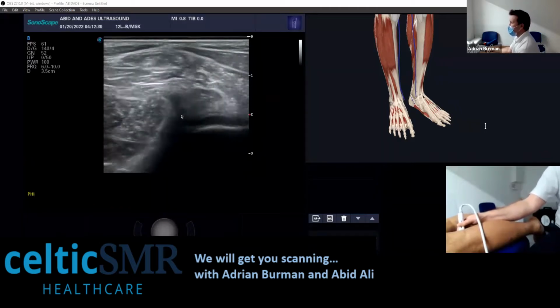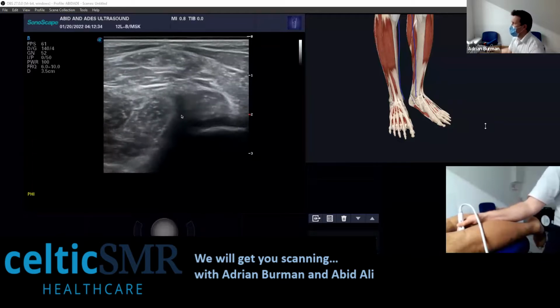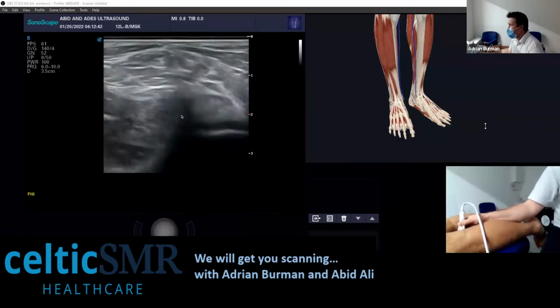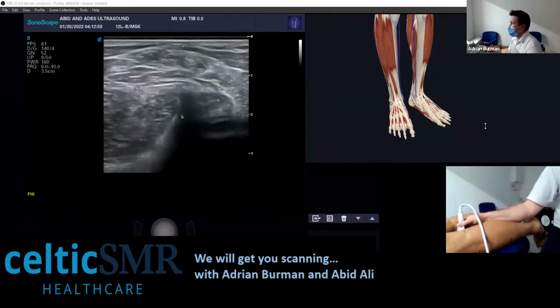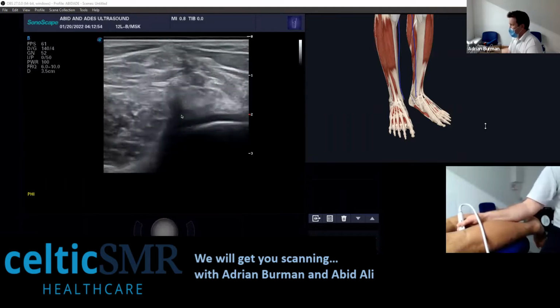Just remember they can be quite complex, Baker's cysts, so put your Doppler on. You can get some Doppler in your Baker's cyst, but put your Doppler on, as long as it's not florid vascularity. Compress, see how it moves. Obviously, you can get complex Baker's cysts with debris when it's sort of organising, septations, all that.